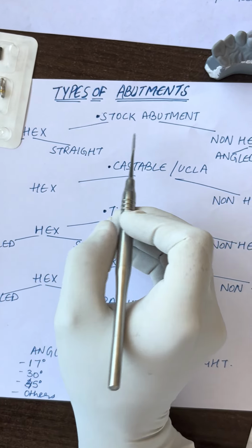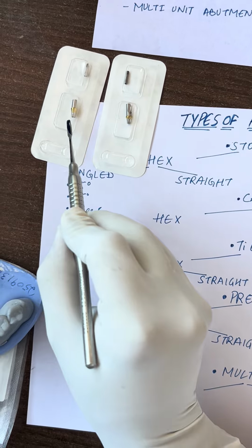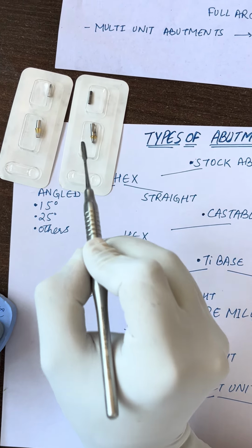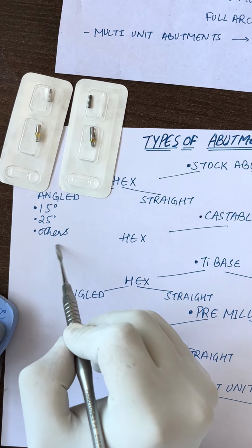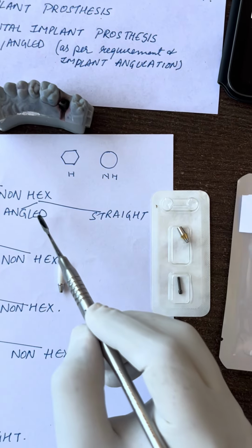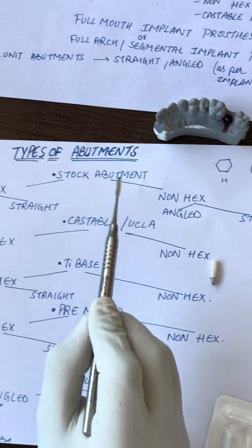So stock abutments can be hex and non-hex as we discussed. They can be straight, or they can be angled. Different manufacturers have different angled stock abutments, like 15-degree, 25-degree and others. Right, here it is a 25-degree stock abutment. In non-hex abutments also you will get angled and straight abutments. So this is all about the stock abutment.